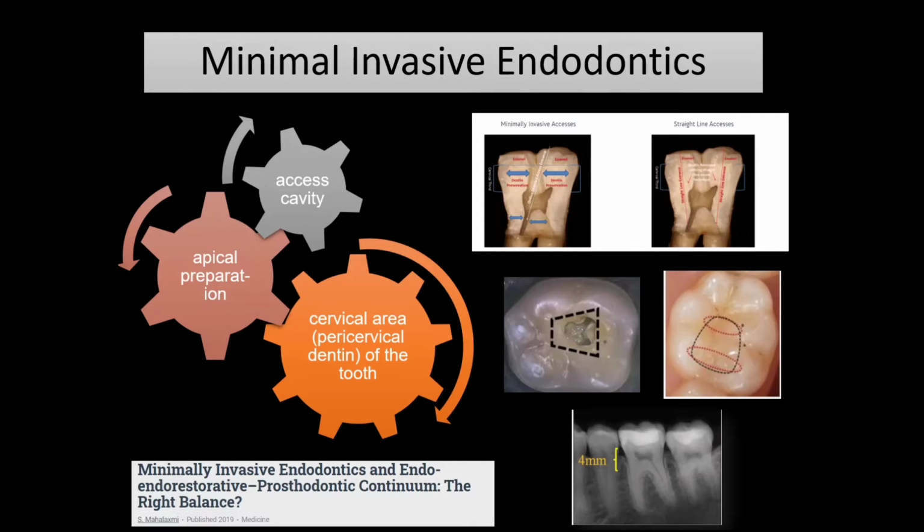Now, in this era of enhanced lighting and magnification, as well as with the introduction of new flexible rotary instruments, it has helped us to achieve the objective of access preparation with the minimal invasive endodontic concept.